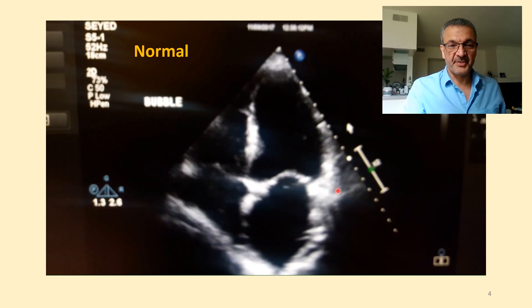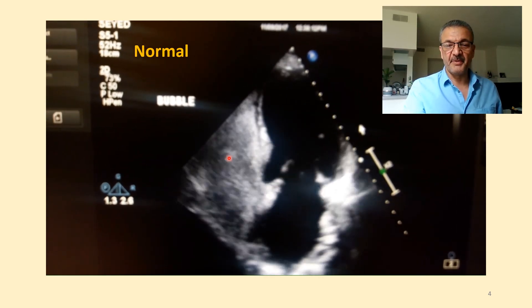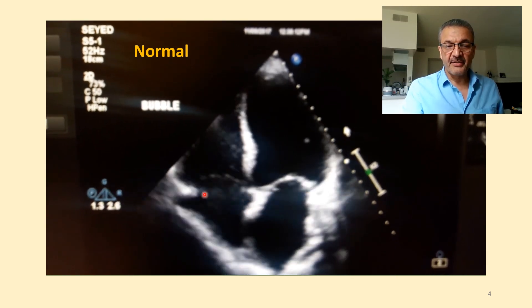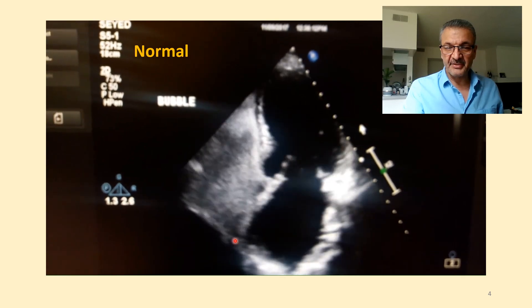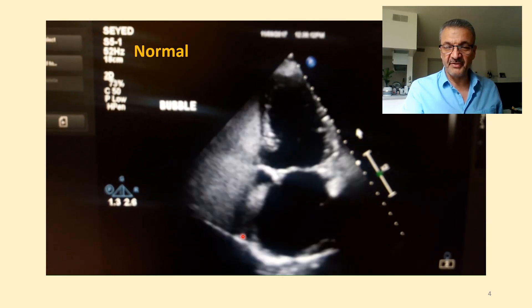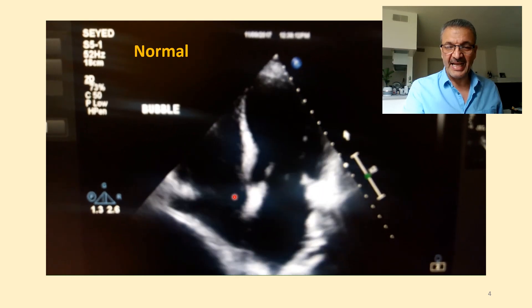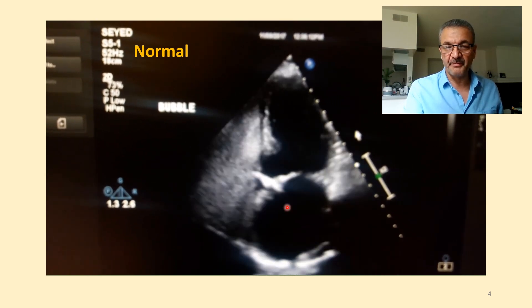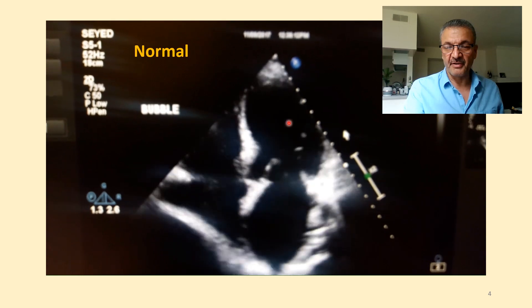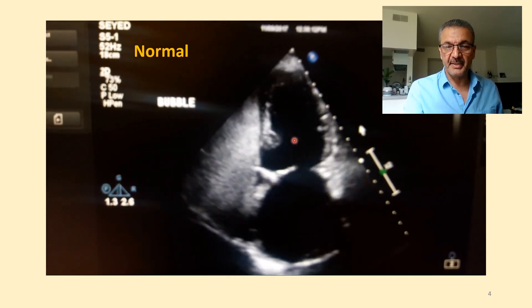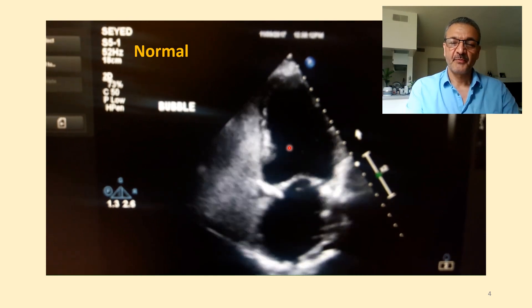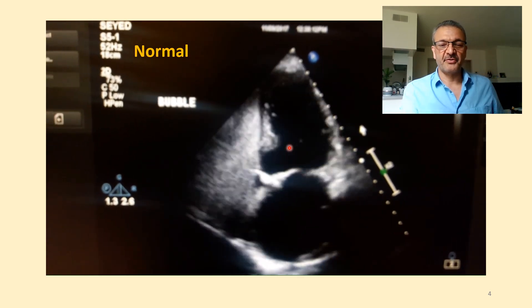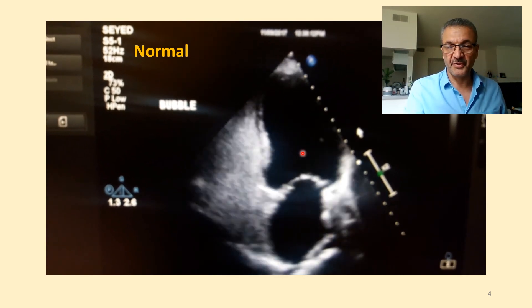Now let's see this patient — first, a normal result. When the bubble injection starts, you can see it filling the right side, the right atrium, completely. Especially the interatrial septum side is completely filled with bubble. There is no defect or lack of bubble at any moment, and there is no bubble at any moment in the left side of the heart. So this is a normal bubble test, meaning there is no right-to-left or left-to-right shunt.